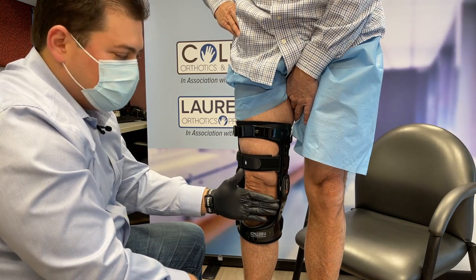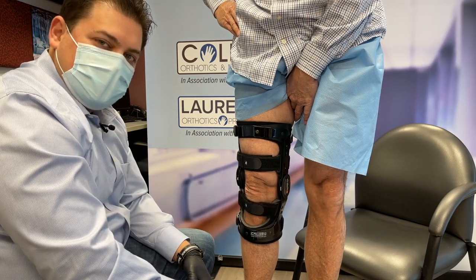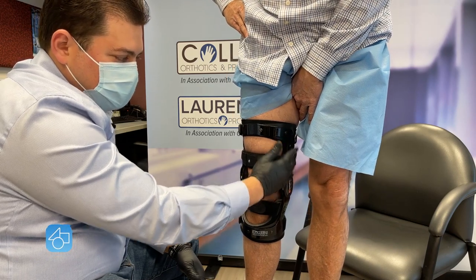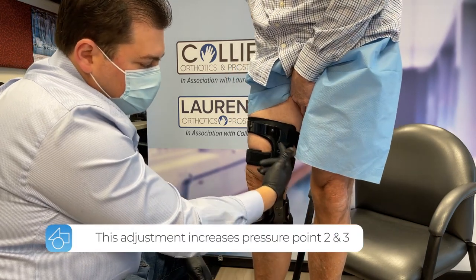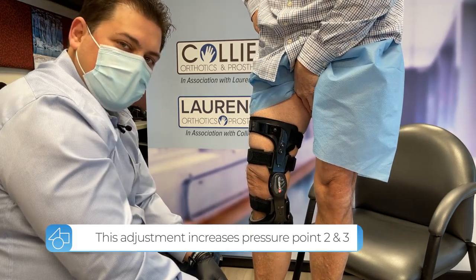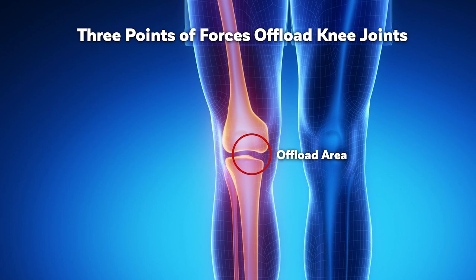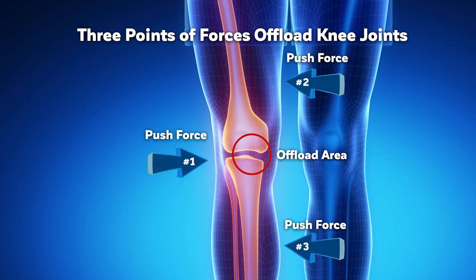What we're going to try and do now is adjust the upright of the brace. As we talked about earlier, we'll be loosening up these two screws and extending the frame on that side. What that will do is angle the brace slightly more, giving him more of that valgus movement we're trying to create — moving that knee inwards.